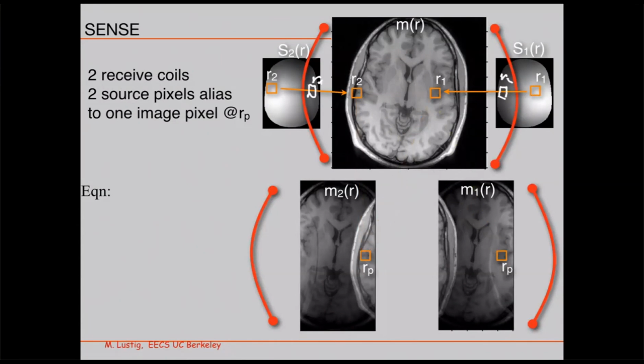So let me just go back. Yeah, so this R2 is multiplied by this sensitivity, and then this R1 is multiplied by this sensitivity. Sorry, again, mistake. It will take me time, but I'll iterate and converge into the right solution, right?